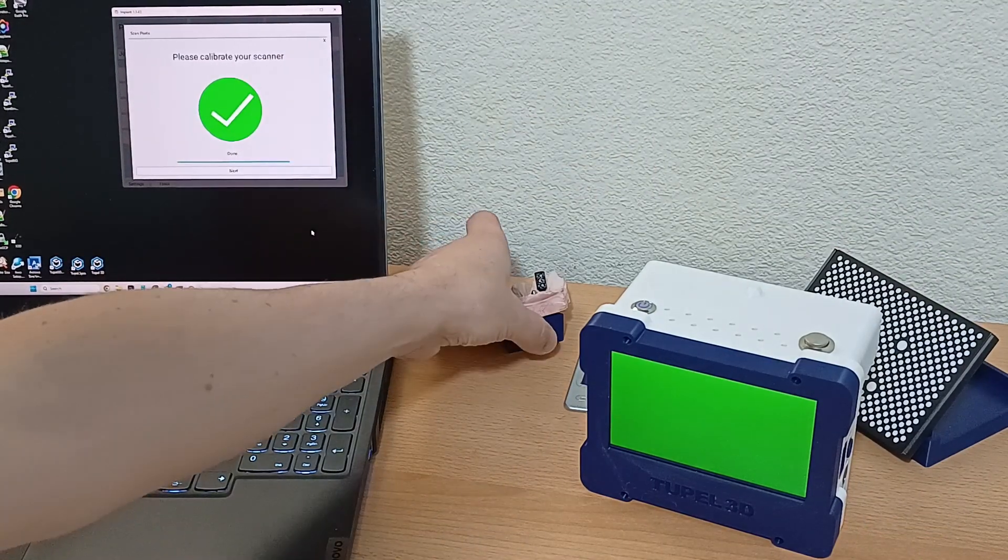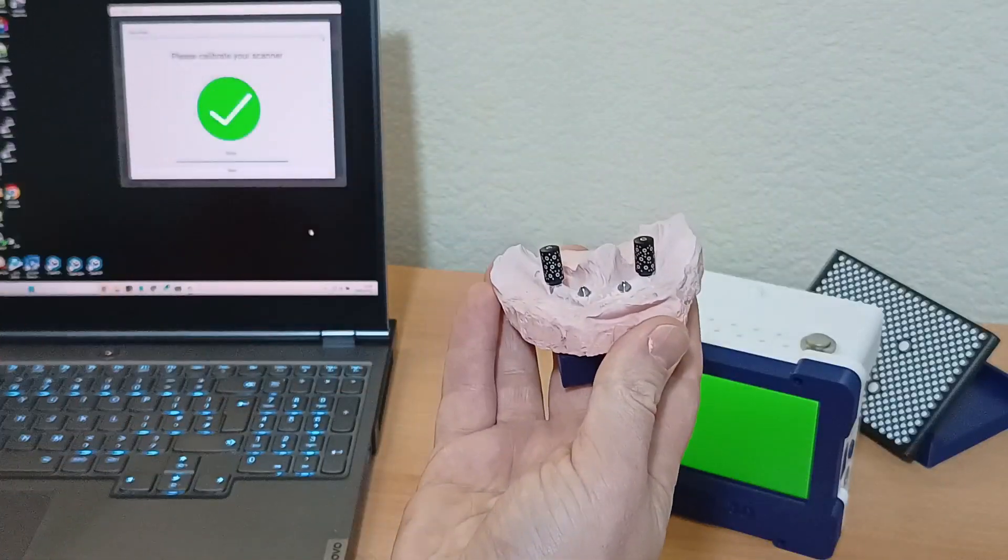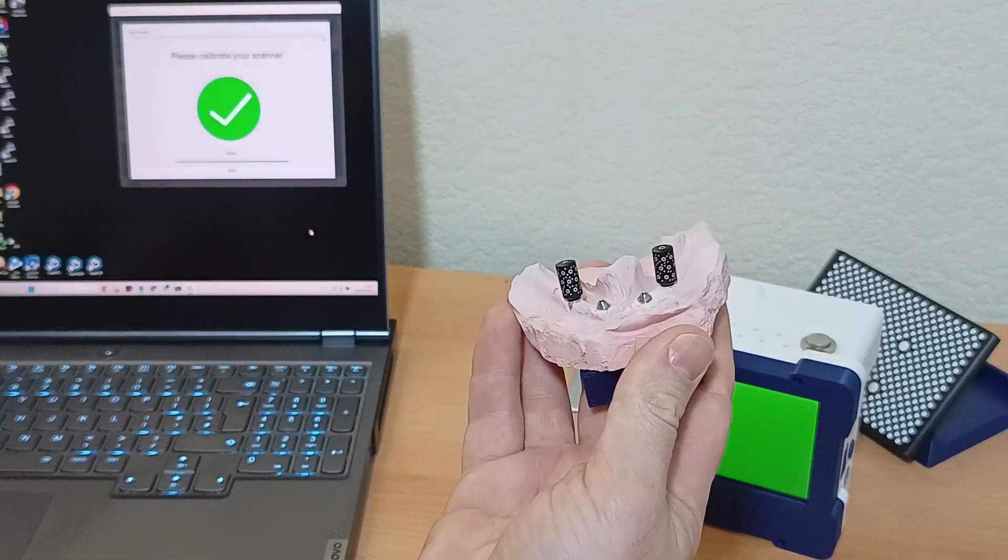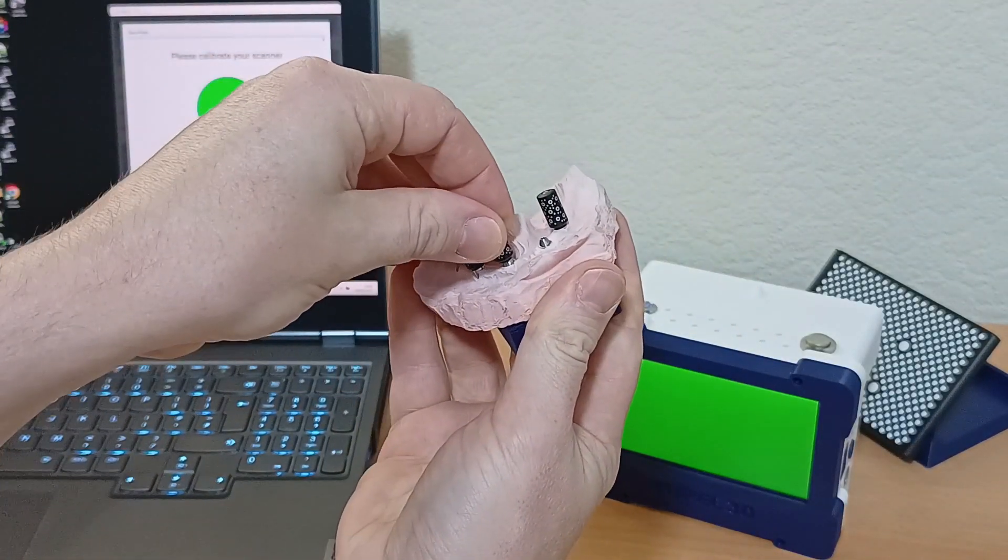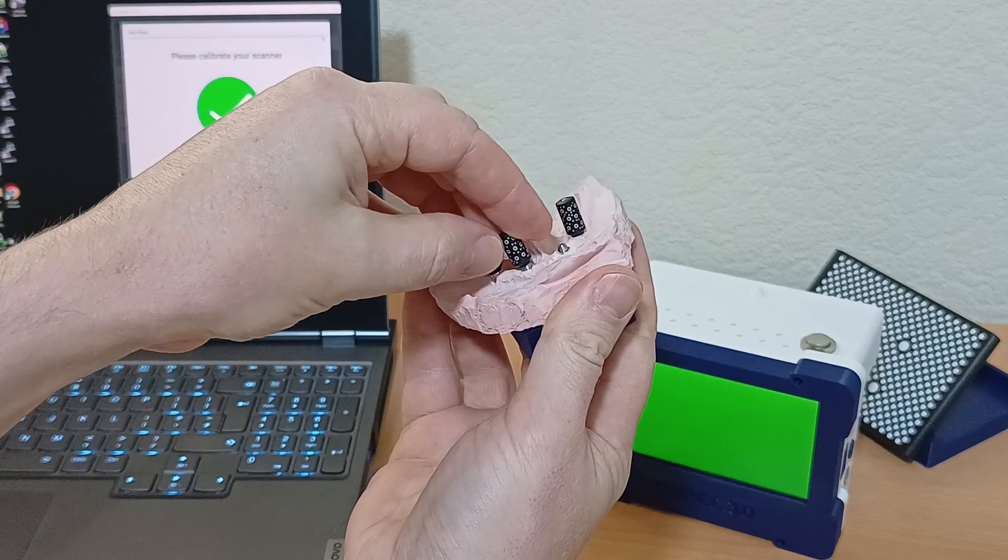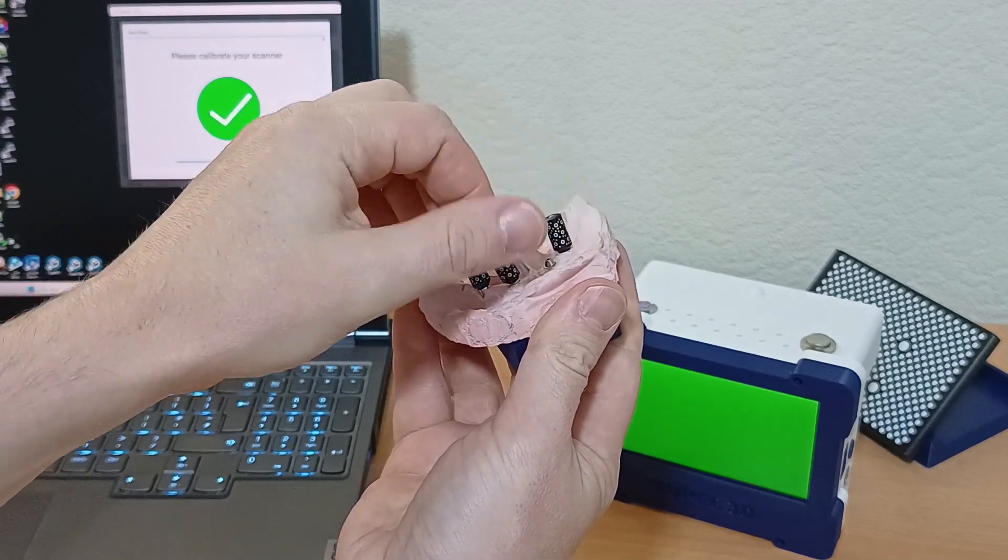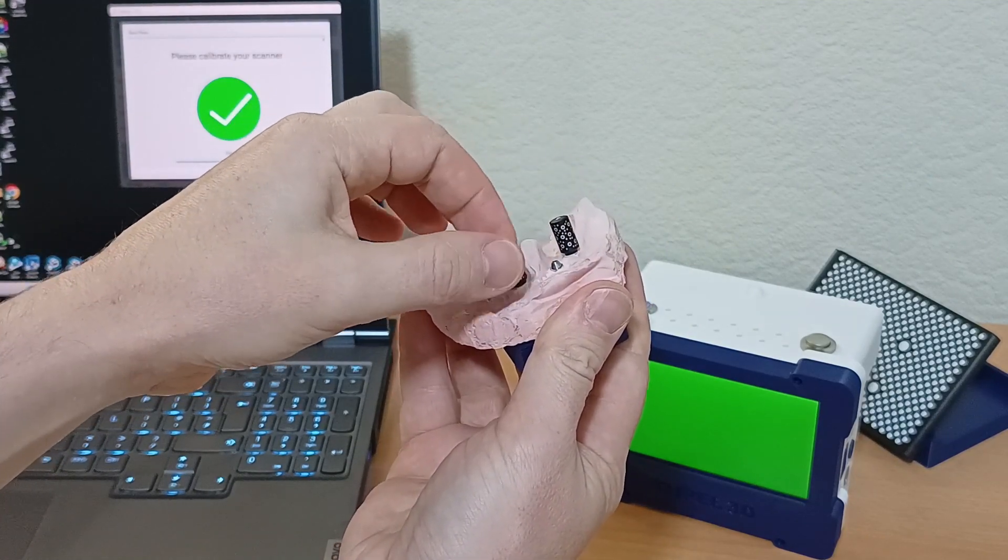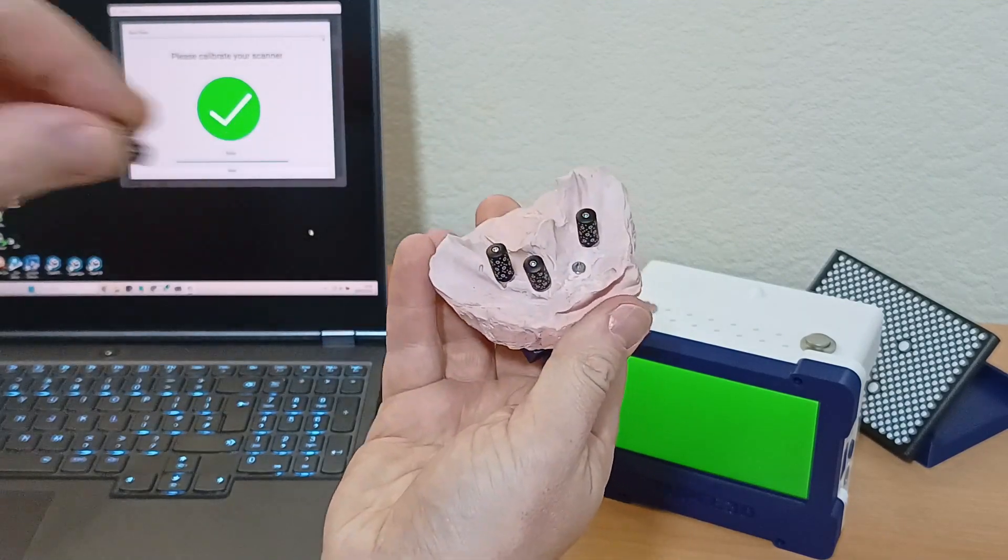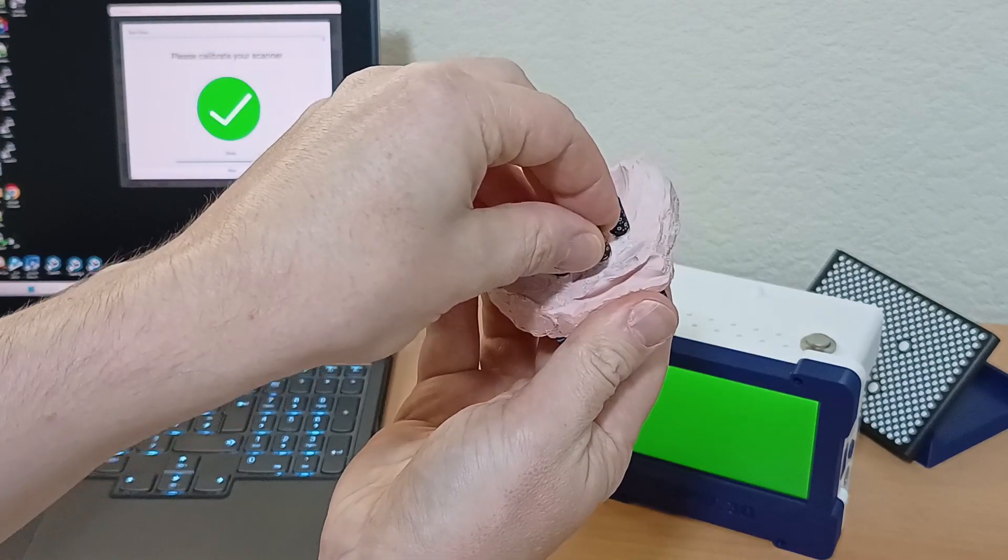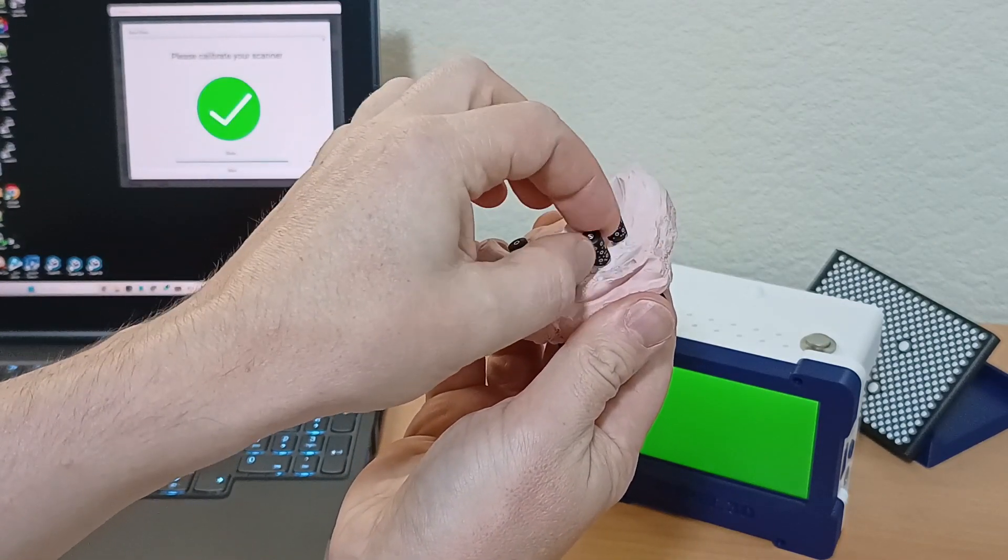The scanner is now ready to use, so we're going to screw in the marker posts to the abutments. Now the scanner is going to measure the position and angle of the abutments with extreme accuracy.